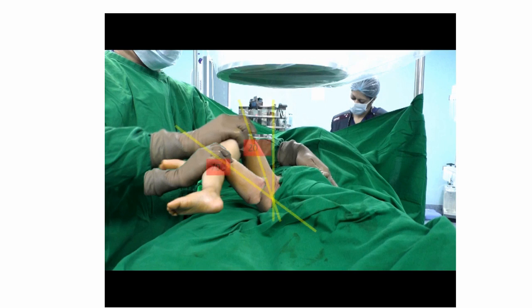You set 2 limits: one is the limit of dislocation, which is 20 degrees abduction, and the limit of AVN, which is at 70 degrees abduction. This zone between 20 degrees and 70 degrees abduction for this child forms the Ramse safe zone. This means if your reduction is stable between 20 and 70, and you give spica midway at 50 degrees abduction, then your risk of AVN is minimized and risk of re-dislocation is also minimized. This is a very important concept to understand when doing closed reduction of the hip for DDH.